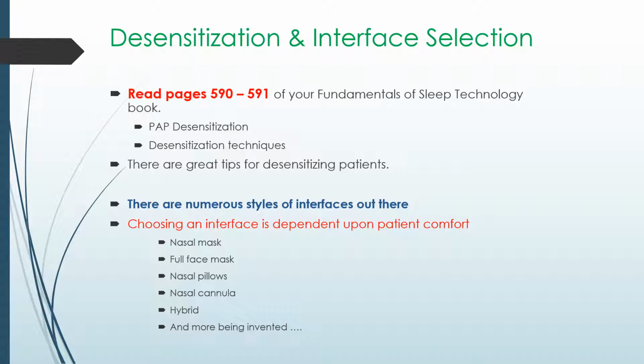Different interfaces to try. There are numerous styles of interfaces out there, and more are being developed every day. So you're somewhat dependent on what your facility stocks, but going to the national meetings, or if your area has a state meeting or a regional meeting each year for sleep technologists, those are great places to learn about different interface devices out there.